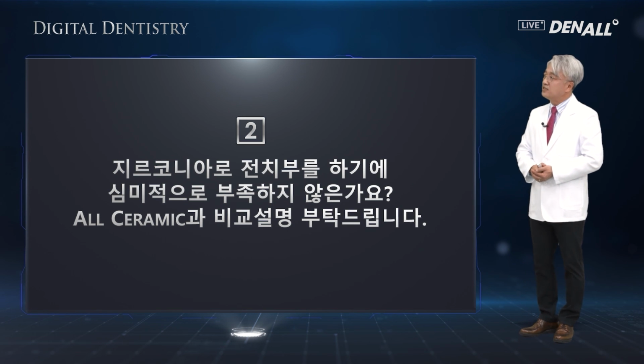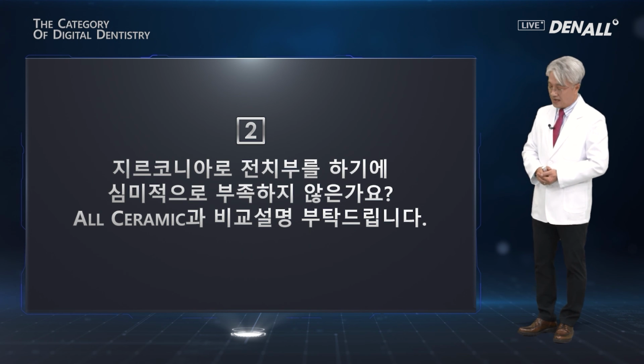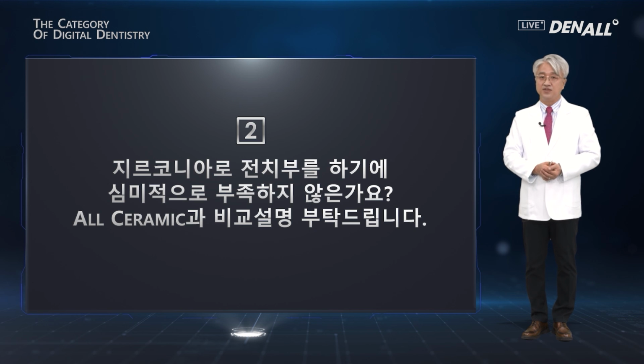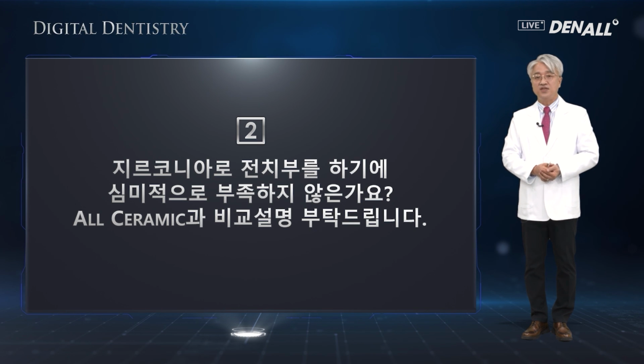Second question, is zirconia aesthetically good to be used in the anterior? Could you compare that to all ceramic? Now, I talked about zirconia, and I said that with trans blocks or gradation blocks being available, zirconia can now also be used on the maxillary anterior side.